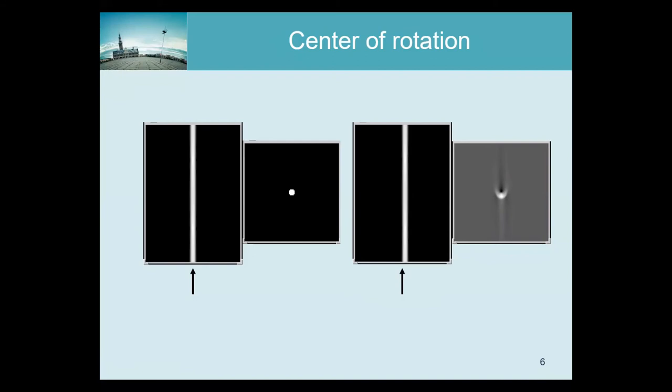That's clearly impossible, because if I look from here and it is at the right, and if I go 180 degrees to the other side, it should be at the left. So there is no such object. And as a result, the reconstruction software will make wonderful artifacts. So for a 180 degrees acquisition, you immediately see the effect, you get horrible reconstructions.